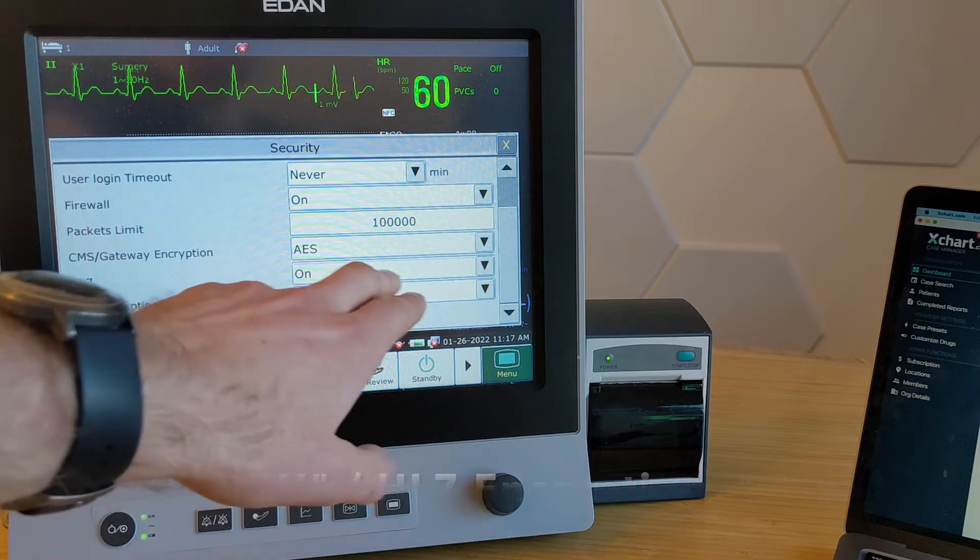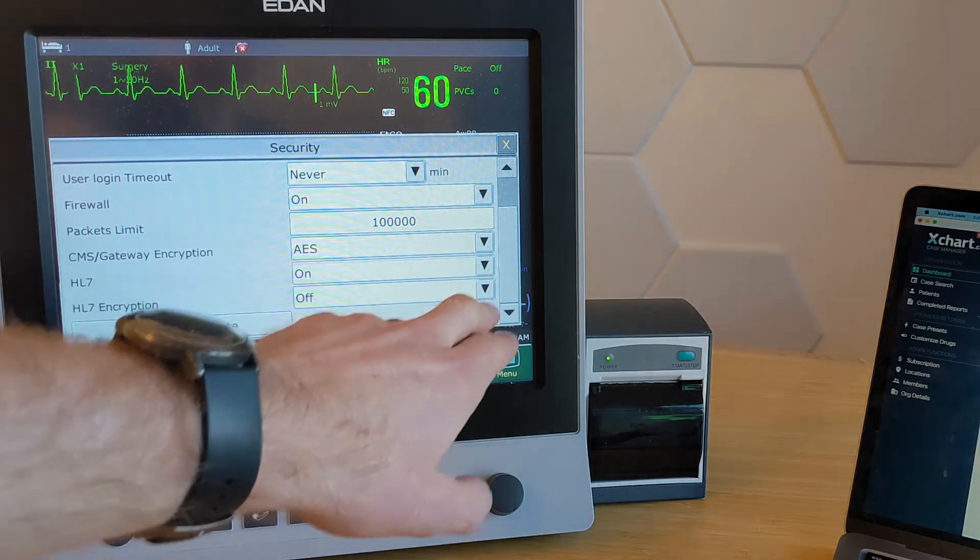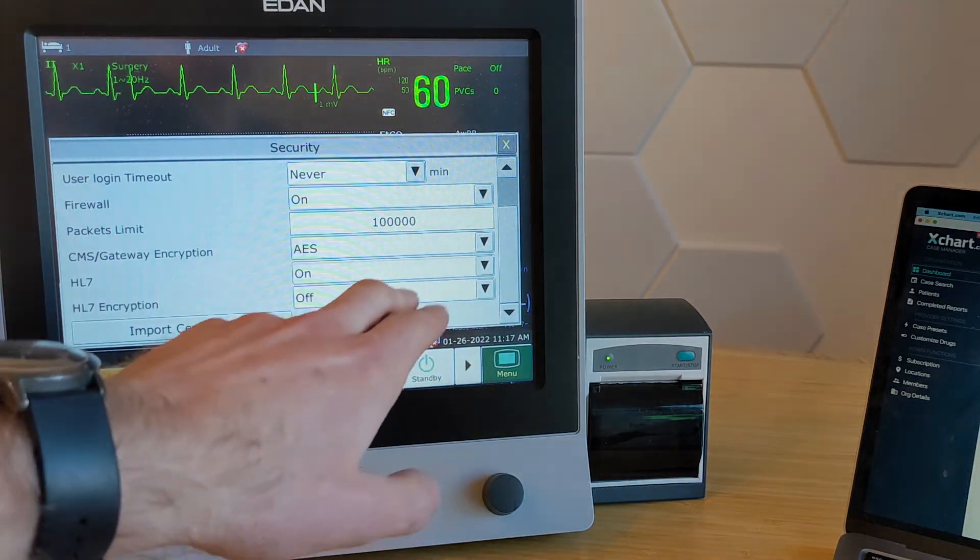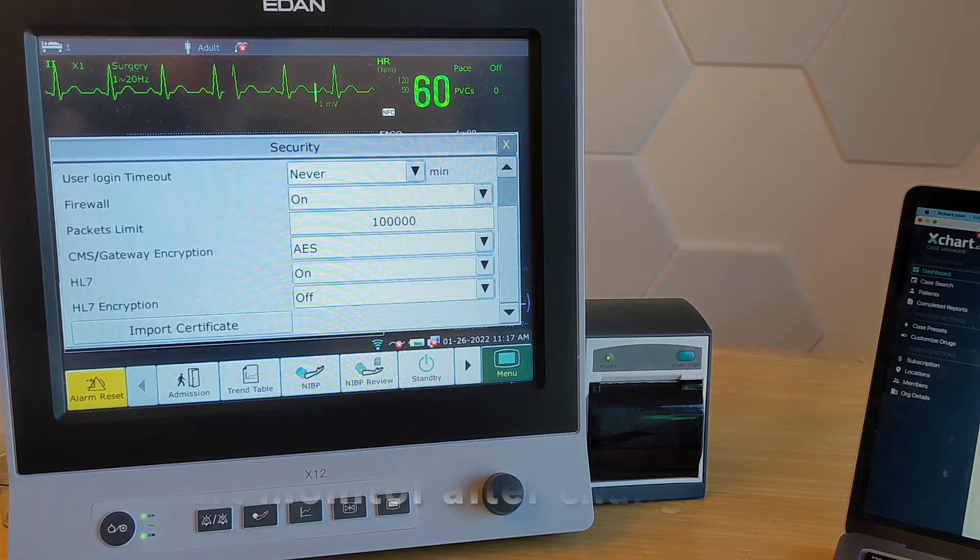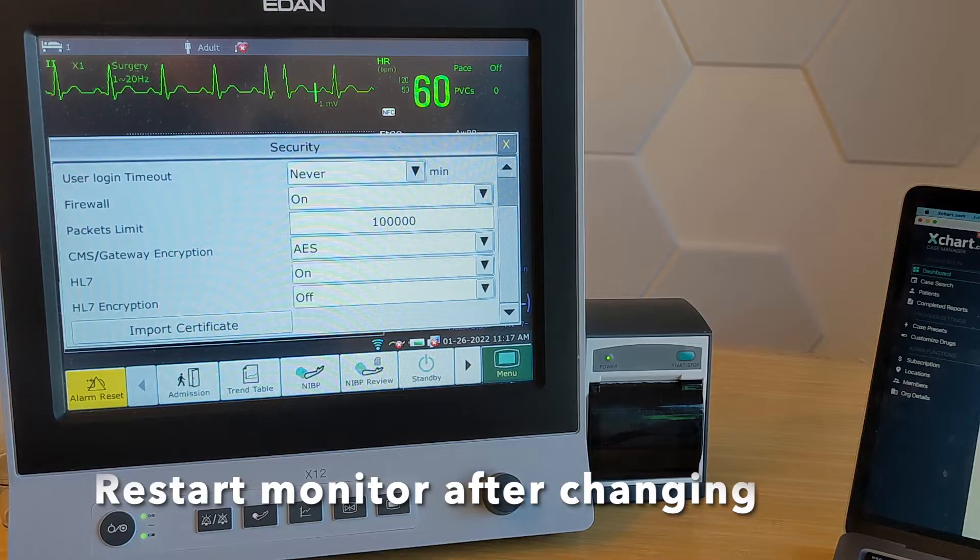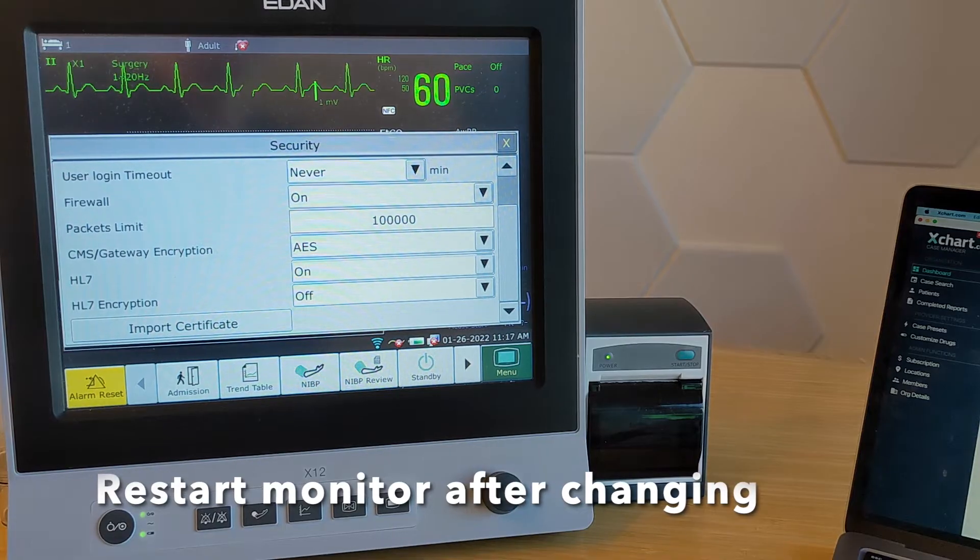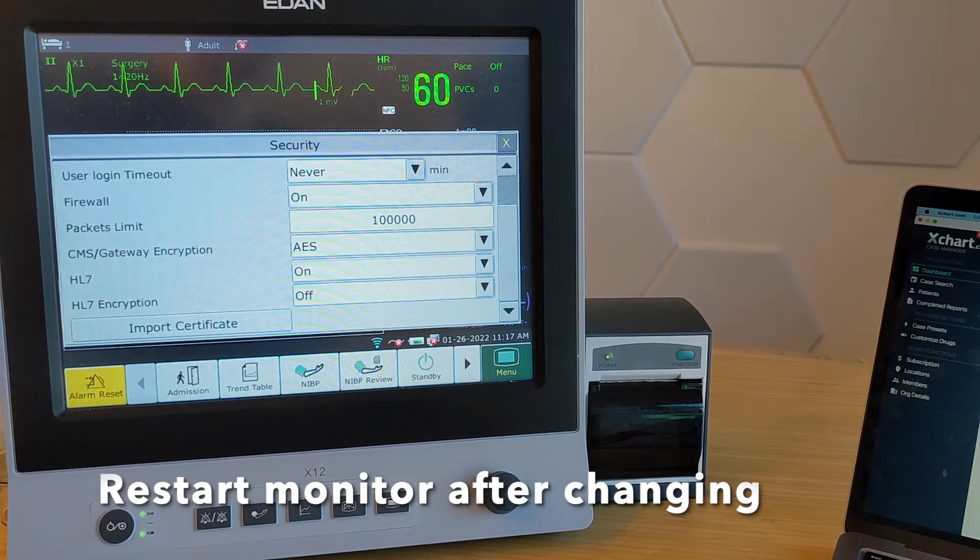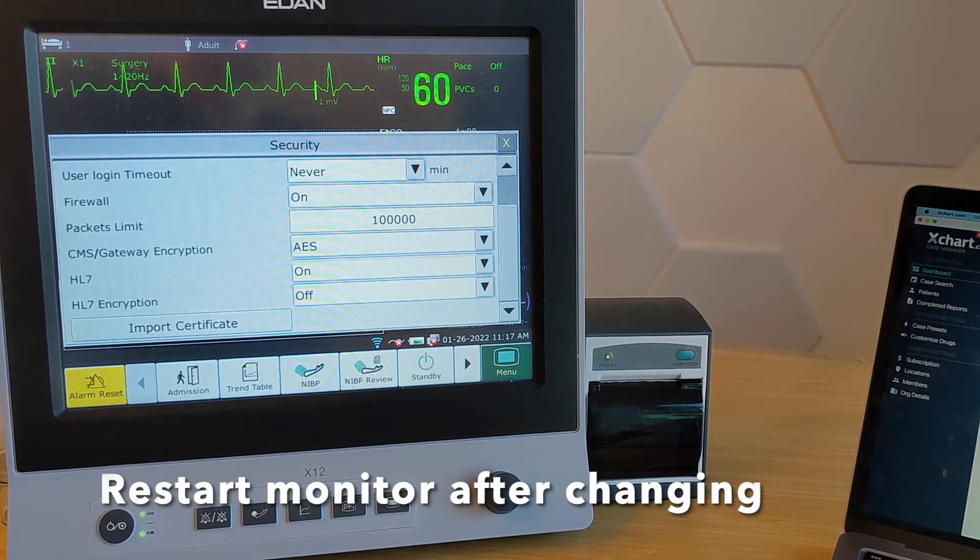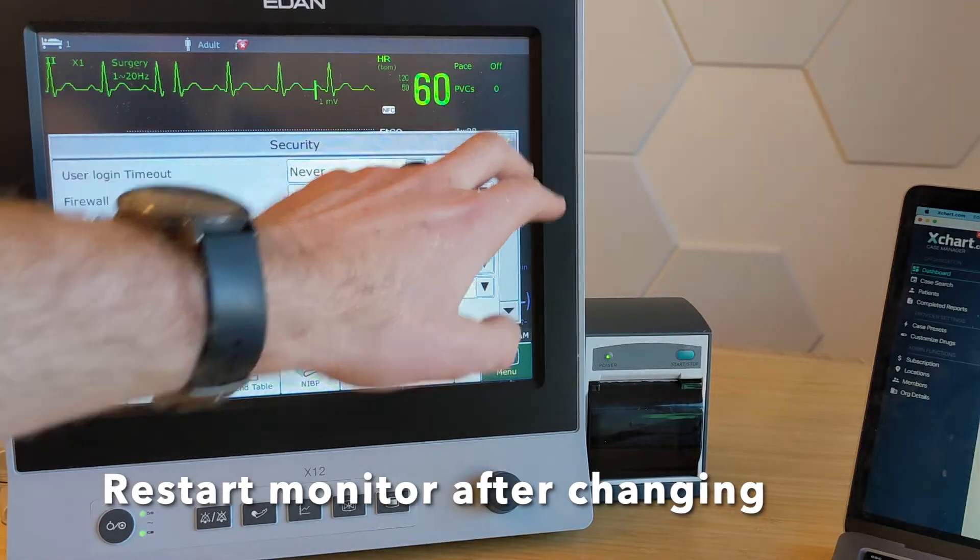That's very important. After you change these, if you make any modifications, it will ask you. It'll say you have to restart the machine to apply those. And you can open the screen again just to make sure it was actually set, but it should be fine at that point.